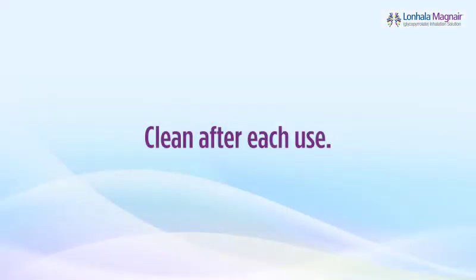Make sure to clean your handset at the end of each treatment, as reviewed in Chapter 3 of this video.